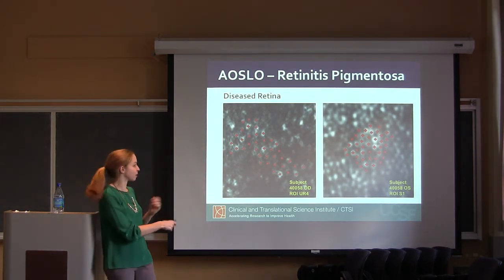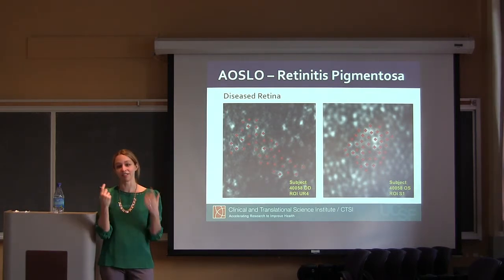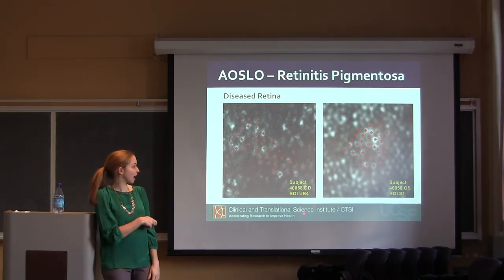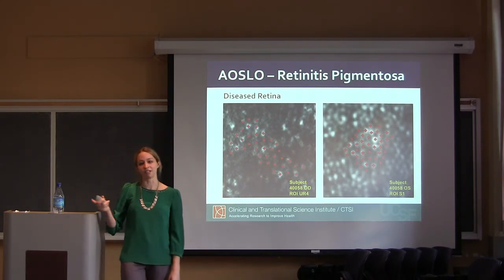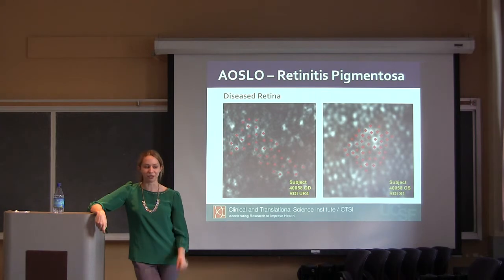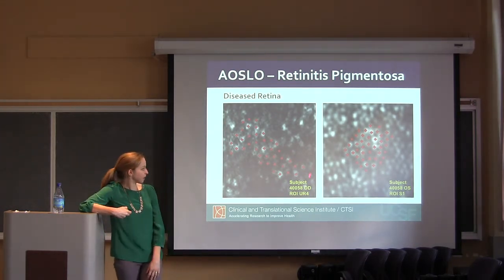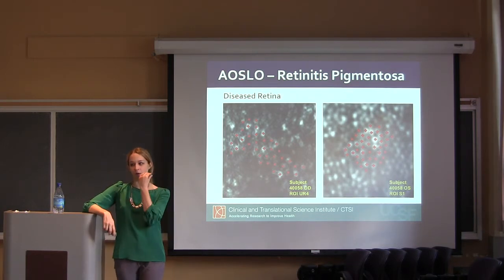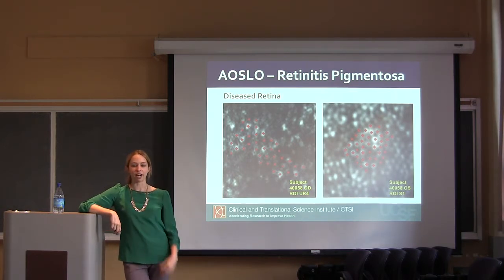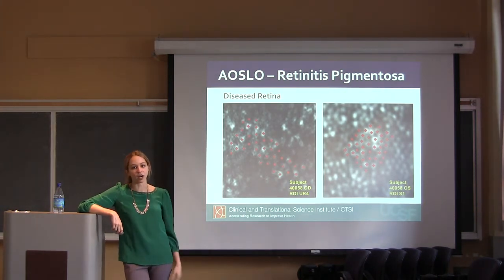Because the resolution is so high, there are different optical aberrations in different parts of the eye. That's part of what's challenging. Like Dr. Duncan was saying with astigmatism, we have to correct for that, and if we don't do that perfectly, that can influence the results. Or say someone has a cataract that's only on part of the lens; you may not get good images looking through that part of the lens, but be fine somewhere else.